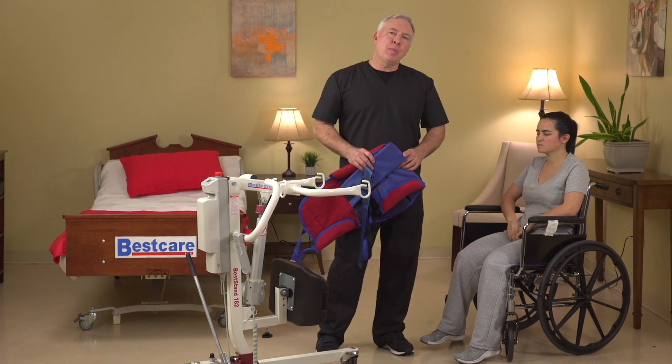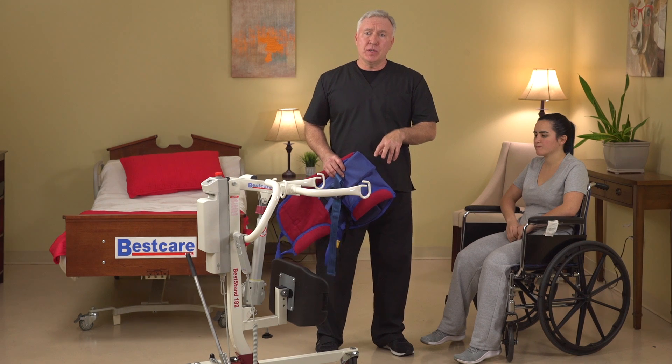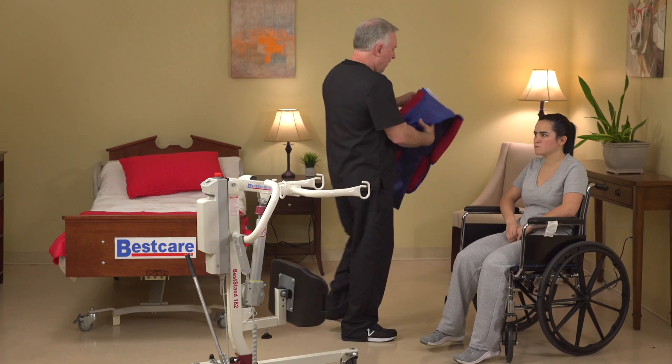Now let me show you how to transfer the patient from the wheelchair to the bed with the SA-182 sit-to-stand patient lift. Let's go ahead and place the sling behind the patient's back.